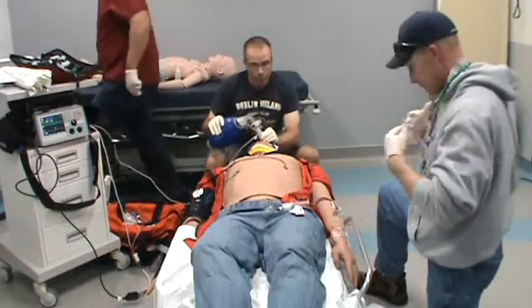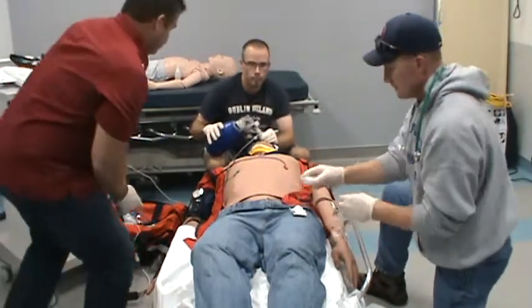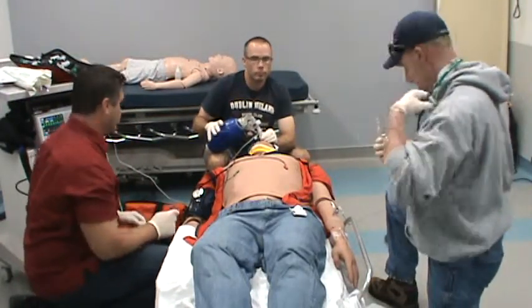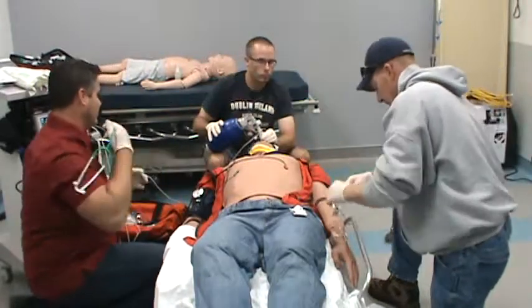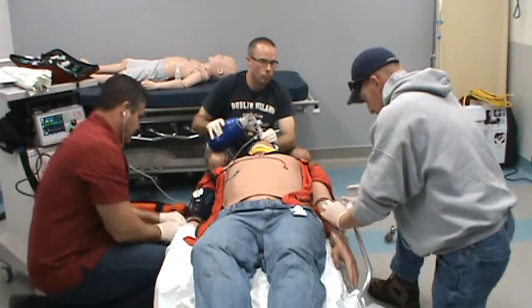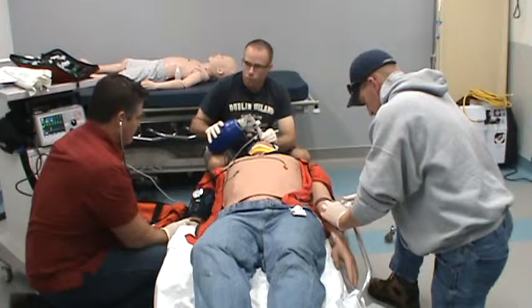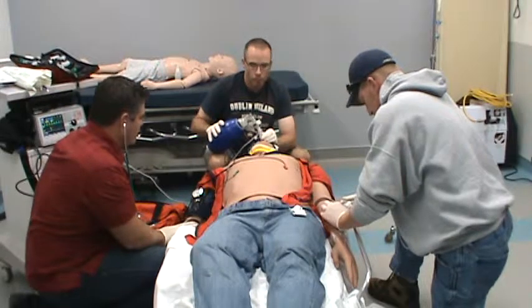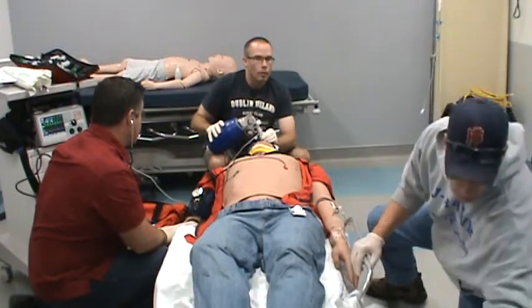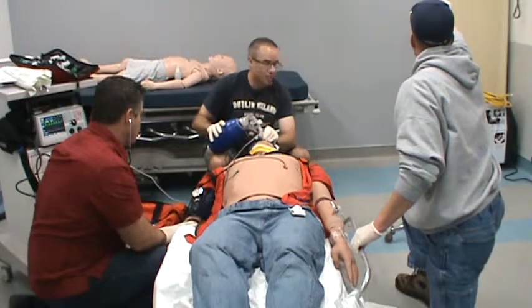Let's go ahead and give the vec. Give 10 mL of vec. Stethoscope for vitals. 10 mL of vec is going in. Okay, we still got good chest rise. Compliance of the bag is still good. Okay, vec is in. Mark the time. Vec goes in at 13:57.